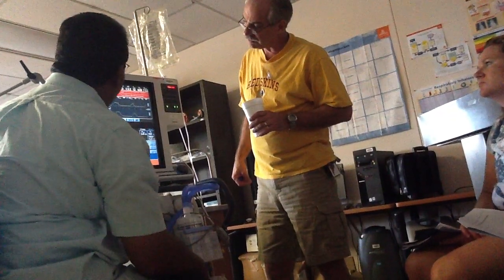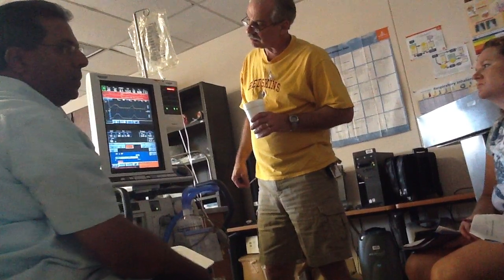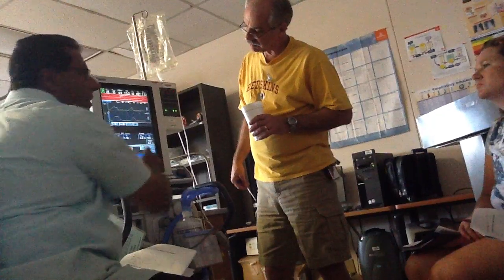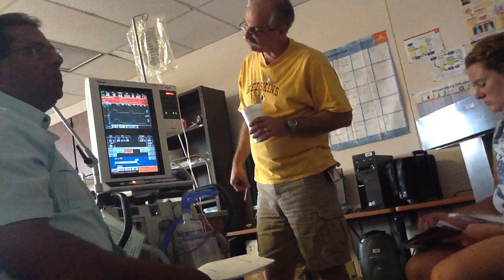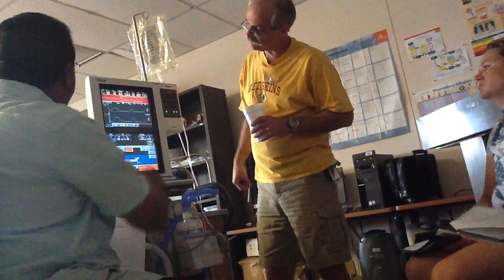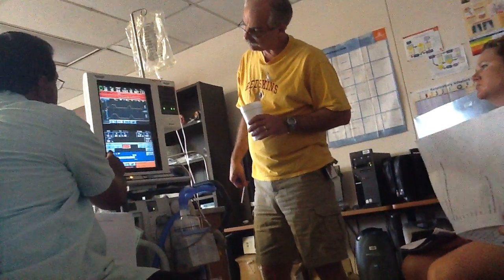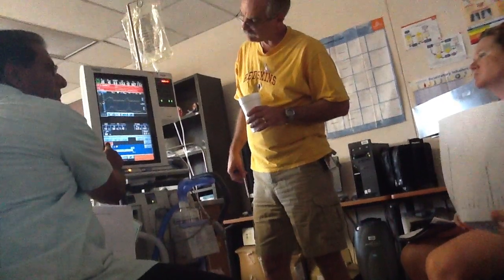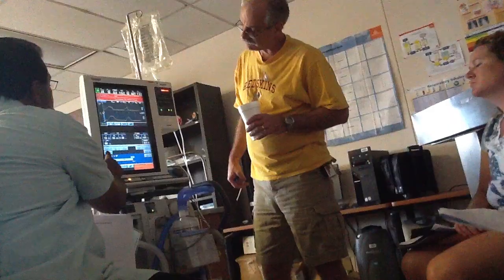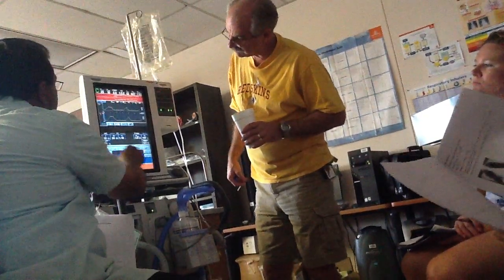And your peak pressure is reading 30. It's 28. That's the alarm, actually. So just leave it at 30. That's going to always show up as 30. Remember that one. And your rise time now stays 50. See, this one is rise time. Don't get confused over that. 50, leave it. This number, leave it. This number, leave it. 30, leave it. 50, leave it.